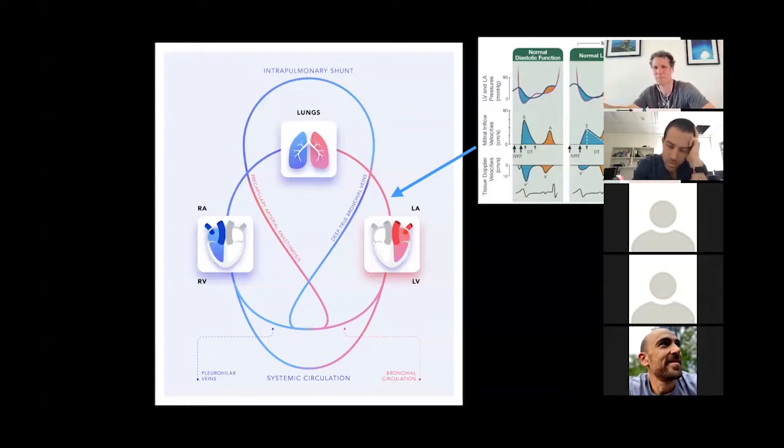And the last is left atrial volume index. If it's enlarged, like 34 is the cutoff. Less than that is normal. I remember 34 is indexed. So I think you've got to say it's indexed. Yeah, nice. Okay, so for me, the E to E prime, 8 I have as the cutoff, and 14 is the higher level. In between those is a gray zone.